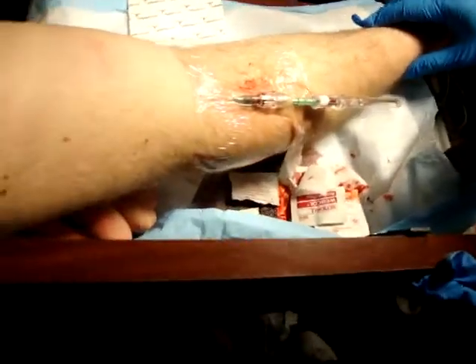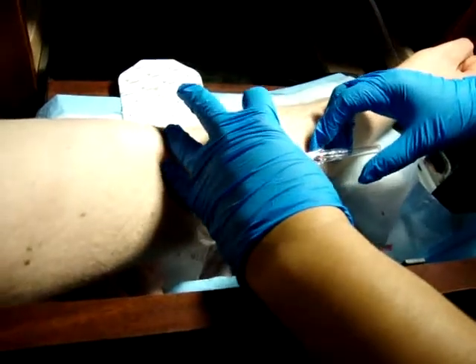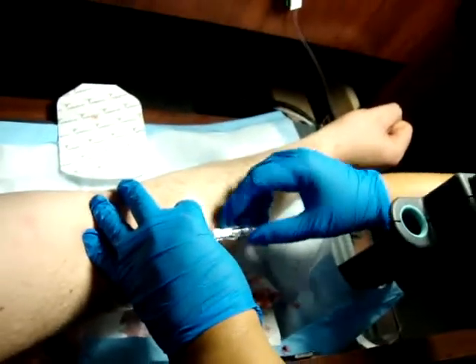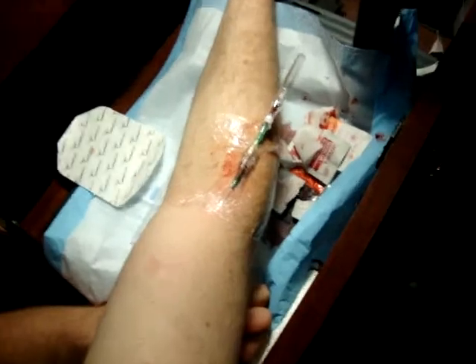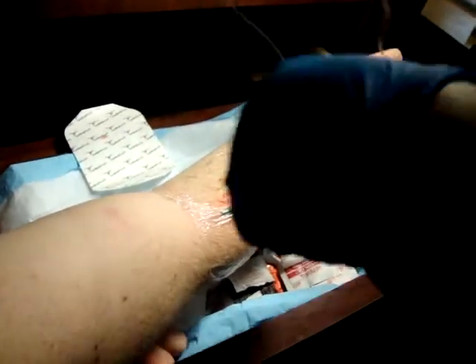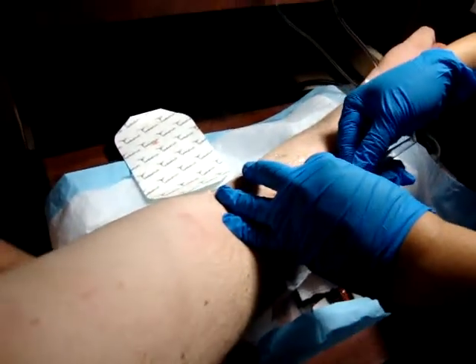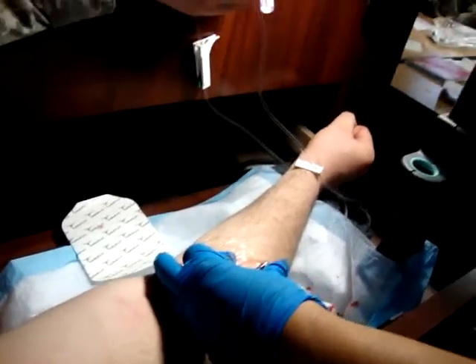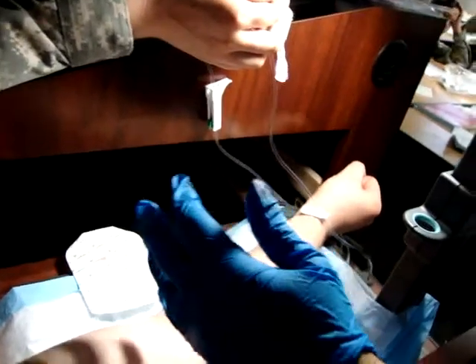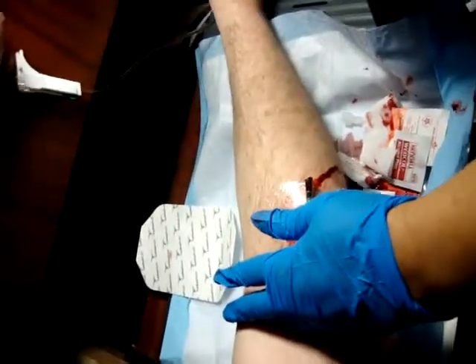As you can see, it's starting to back up with blood as well. You're going to clap it off the best way you can. Hold on to the green part. Make sure that you have your tubing with your flow ready. You're going to pull this out, leaving the hub inside the saline lock. And yes, it is a direct line into the vein — so yes, they can bleed out from that. Make sure that you clap off that vein the best way you can.